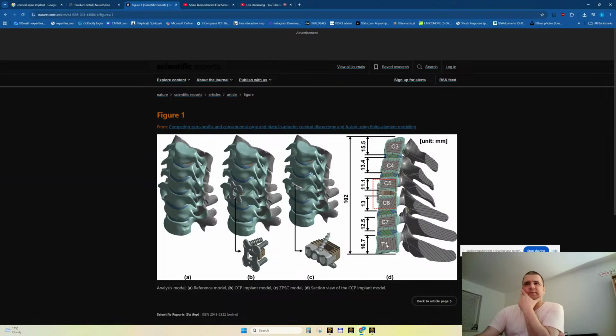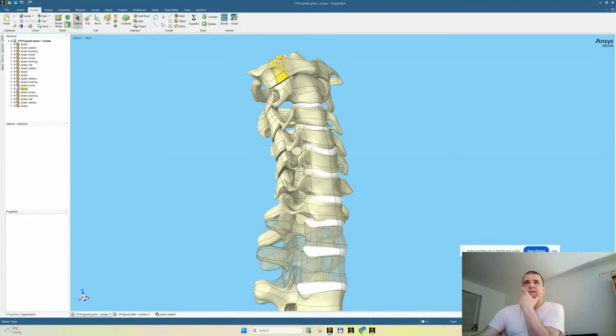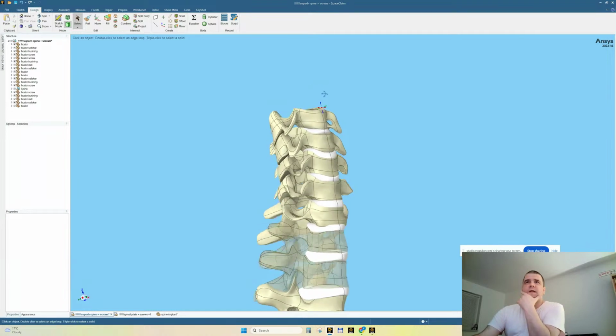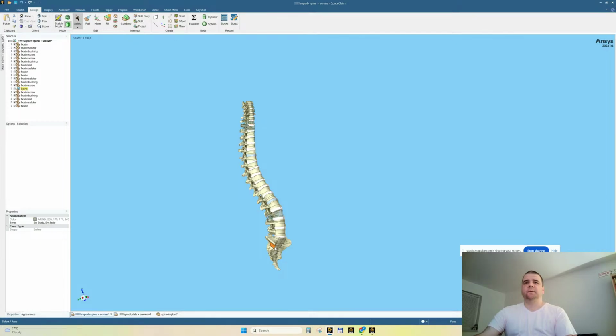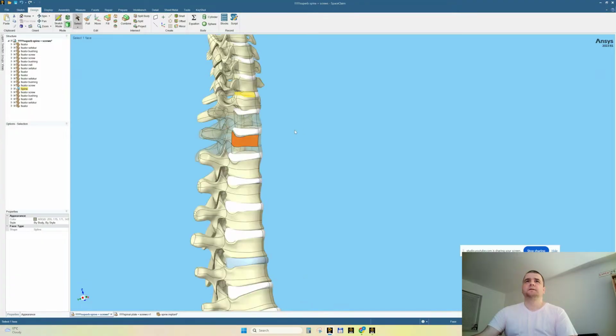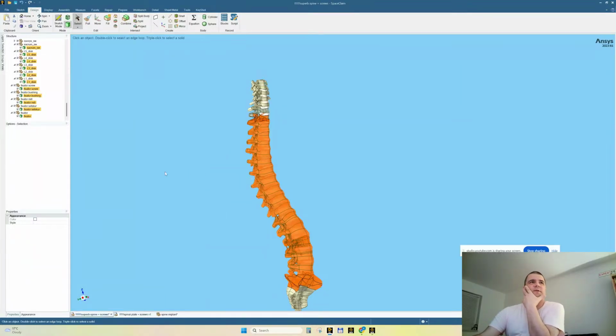So let's do the same. We will delete C1 and C2 and keep T1. This is T1. So let's delete the first two. 1, 2. We don't need the cartilage, of course. And everything that is below here with Control pressed. Yes. Let's do something like this. Right click, locate in structure tree.